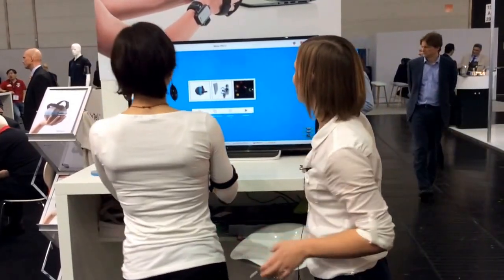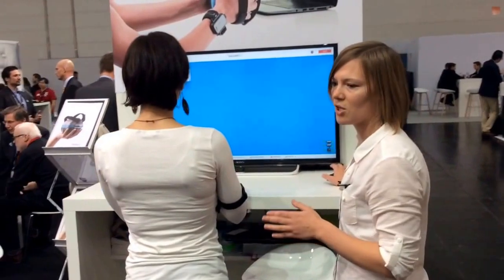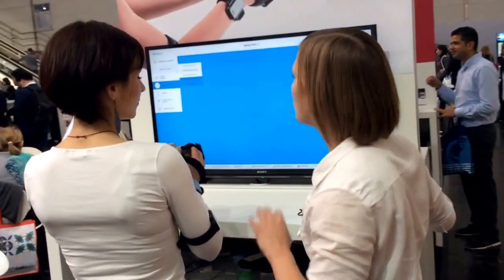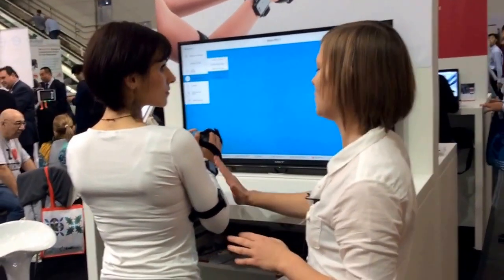Let's make the settings. We are choosing bimanual training in different planes — it can be vertical, horizontal, on a support surface, or on a support sphere for wrist training. We can also train just the separate joints of the arms: just the shoulder, just the elbow, or just the wrist.